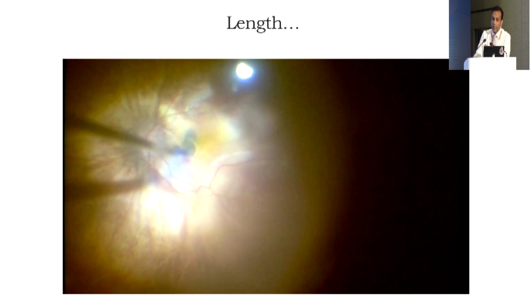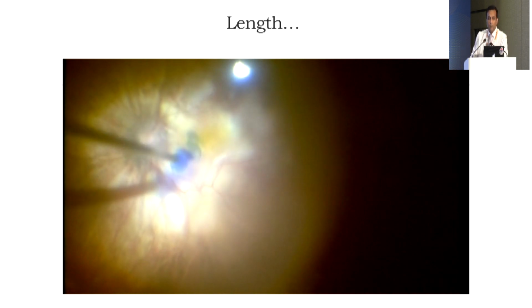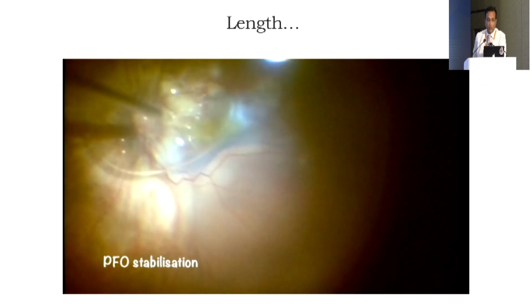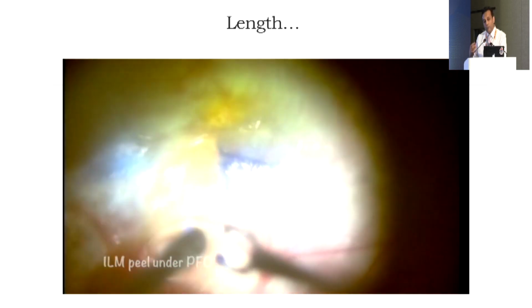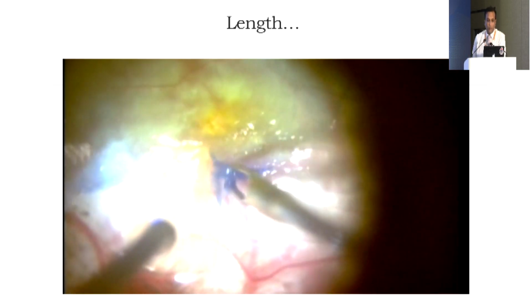The third point, the length. There are many ways to circumvent the high axial length. You have to make the trocars posterior. You can go to 4.5 mm, and you can remove the cannula part to increase your maneuverability.